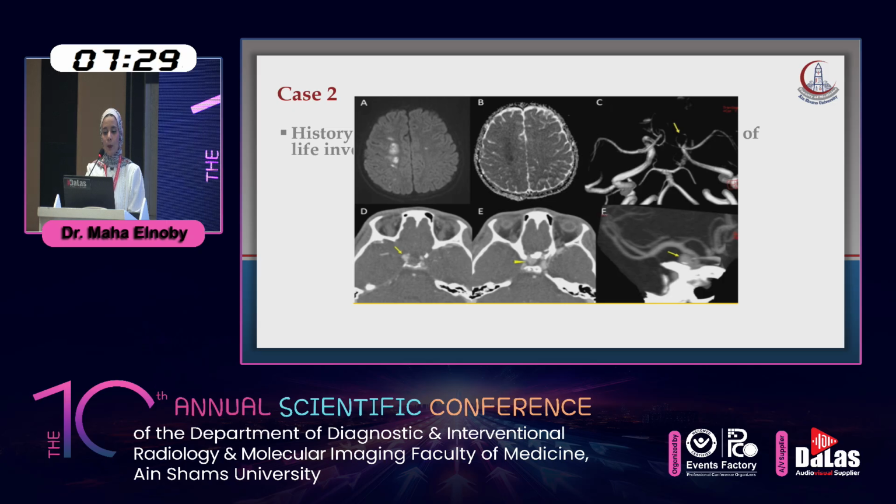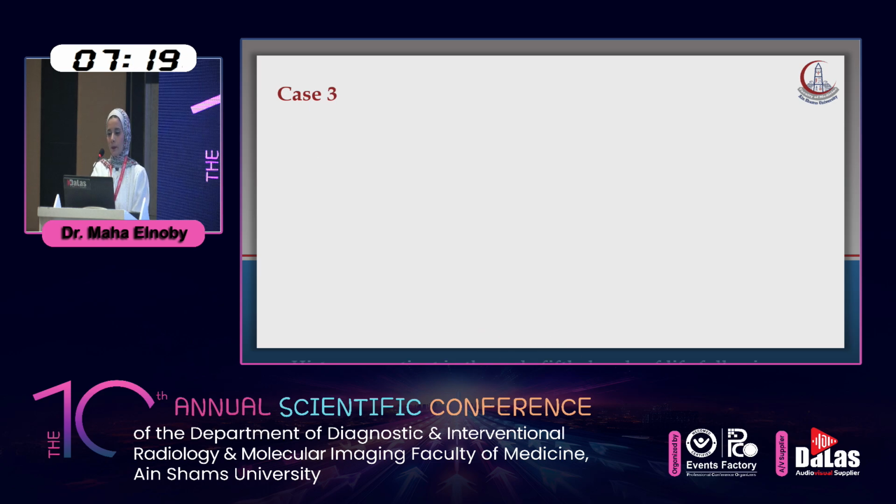When it was done after 3 weeks, CT angiography showed a bilobed aneurysm in the supraclinoid and cavernous portions. The CT angiography map shows a pseudoaneurysm in the supraclinoid portion. This is grade 3. Pseudoaneurysm is grade 3.